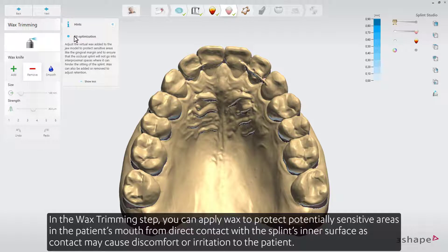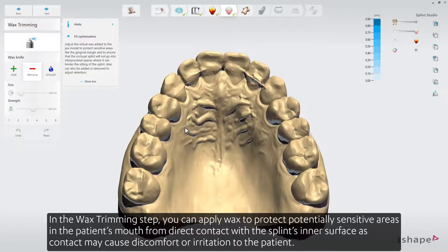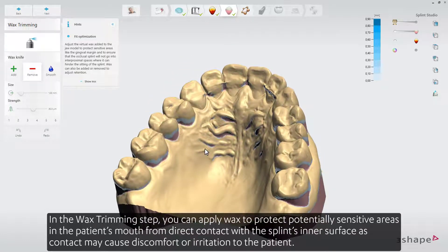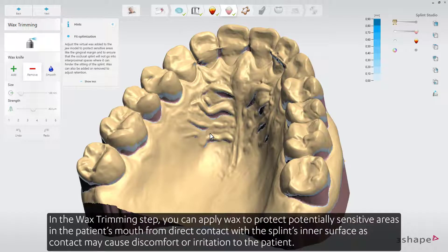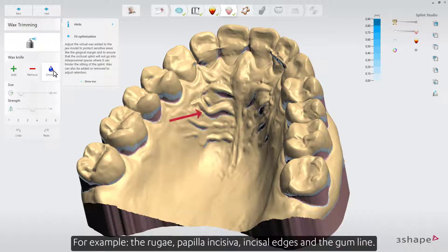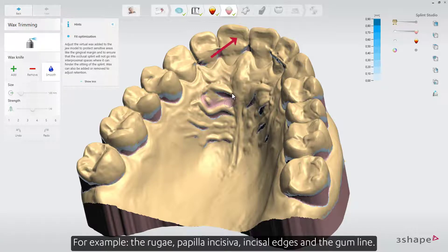In the wax trimming step, you can apply wax to protect potentially sensitive areas in the patient's mouth from direct contact with the splint's inner surface, as contact may cause discomfort or irritation to the patient. For example, the ruga, papilla incisiva, incisal edges, and the gum line.